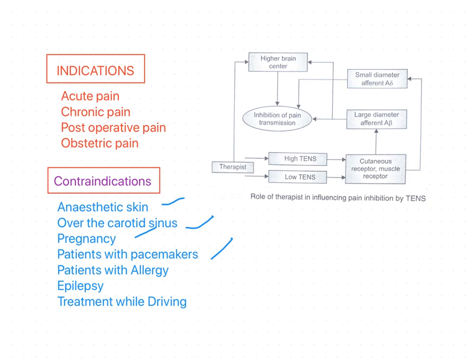Nowadays such pacemakers are rarely used. So these are some findings, but it is better not to use TENS on patients with pacemakers.